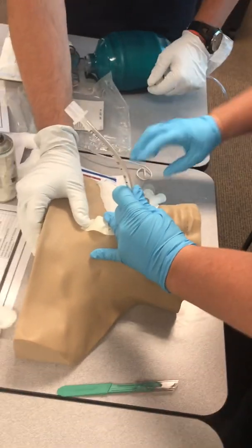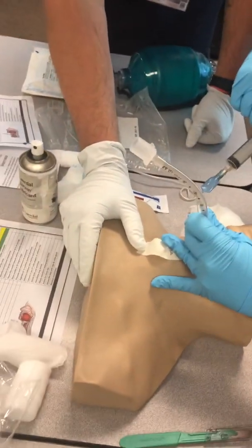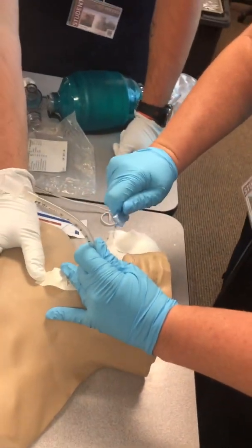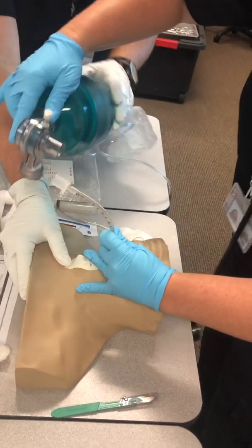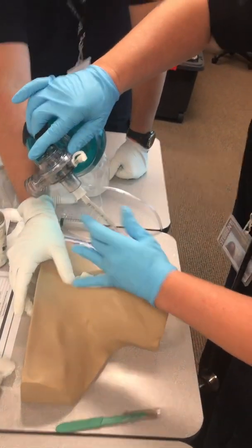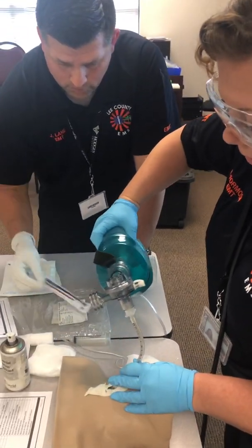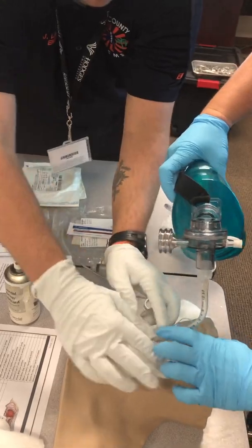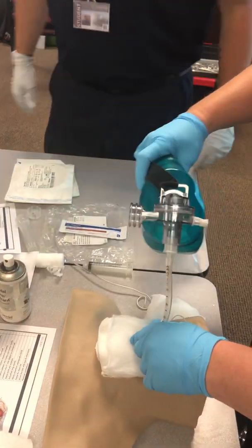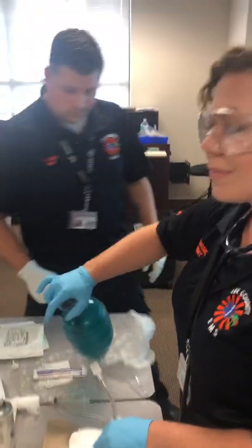Remove the stylet — she had it at a 90 degree angle. This is a traditional ET tube, so it's longer. Ventilate and auscultate over the epigastrum and then over the lungs. For confirmation devices, use end-tidal capnography or waveform capnography. Listen, listen, listen — and then secure the tube. Thank you very much.